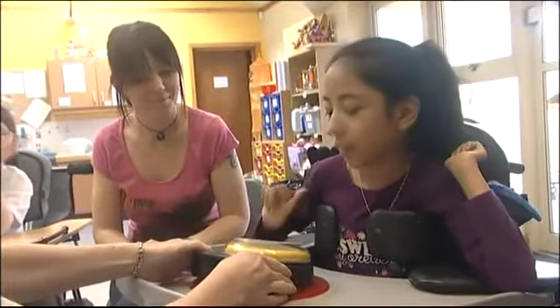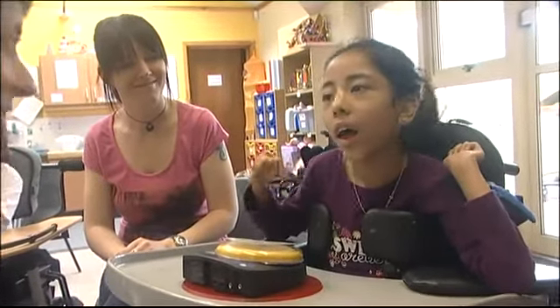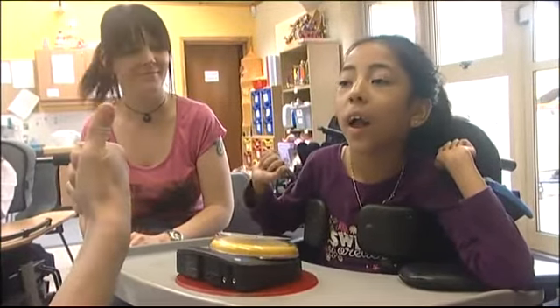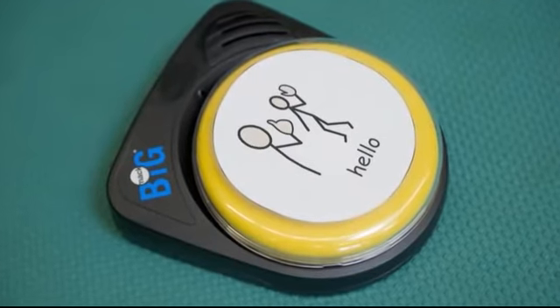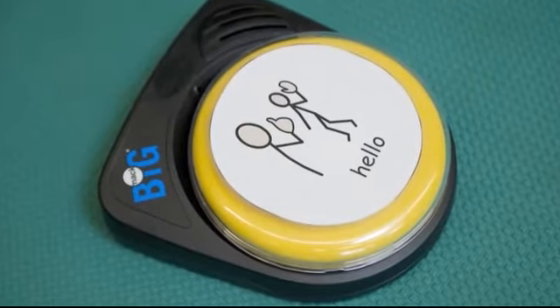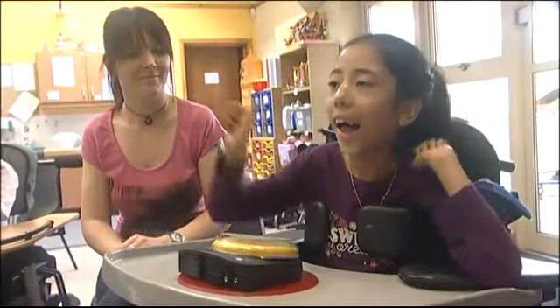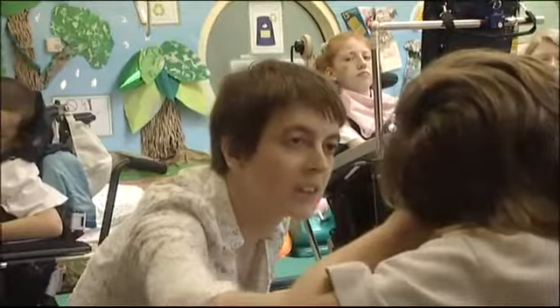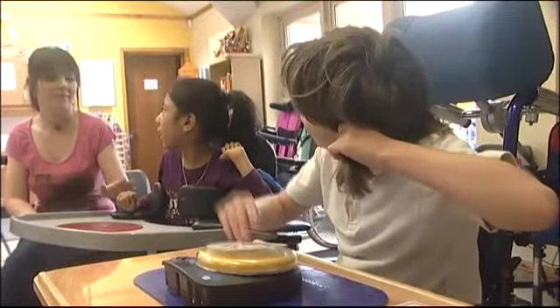Alia is only able to exert slight pressure using her fingers, and she constantly tremors, which makes it very difficult for her to control her movements accurately. She uses a Big Mac switch to do simple messages like hello, and she is learning to use and recognise symbols. Alia does also use a couple of Makaton signs as well to indicate when she's finished, to say please and more. Alia, can you say good morning to Annalise?